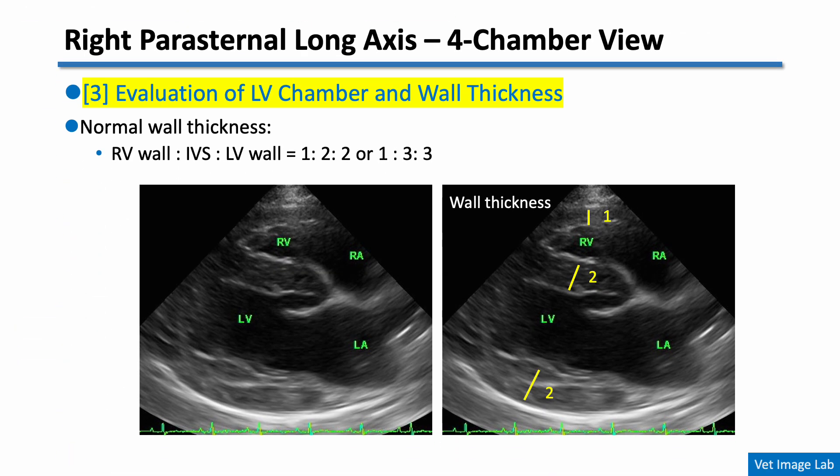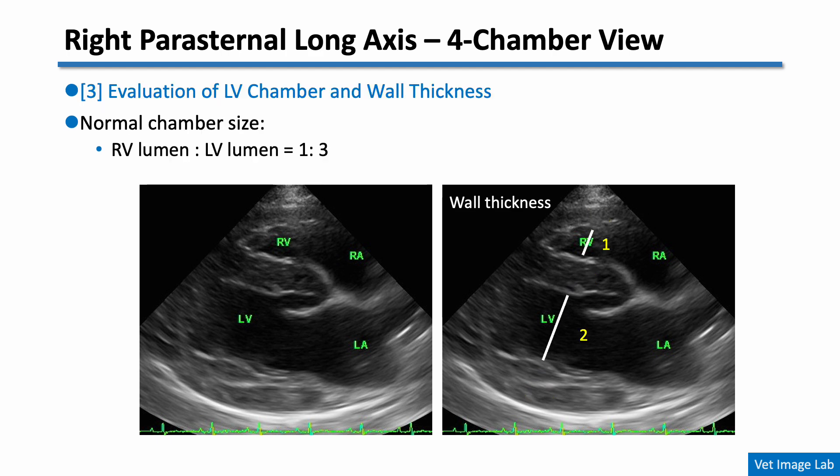Now let's move on. In this four-chamber view, you should assess the left ventricular chamber and wall thickness. Specifically, check the relative thickness of three components: the right ventricular wall, the interventricular septum, and the left ventricular free wall. The right ventricular wall is much thinner than the septum and the LV free wall — normally the ratio is approximately 1:2:2, or in some dogs 1:3:3. You should also evaluate the size of each ventricular chamber. Normally, the right ventricular cavity is approximately one-third the size of the left ventricle.